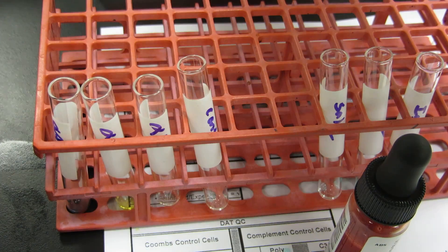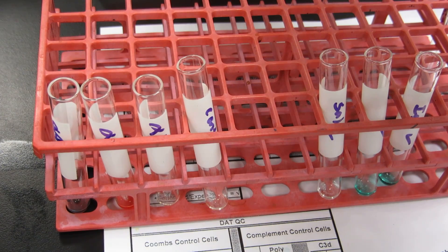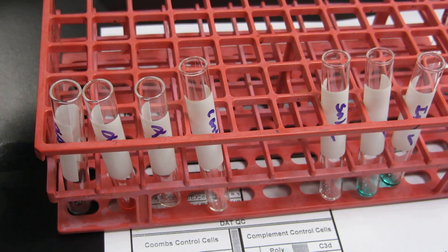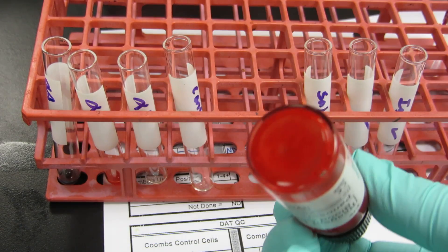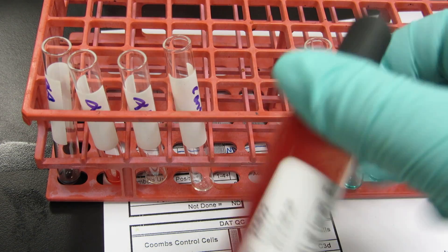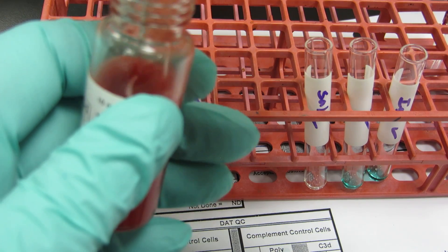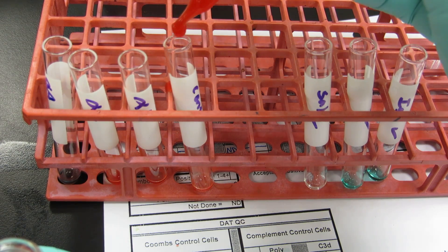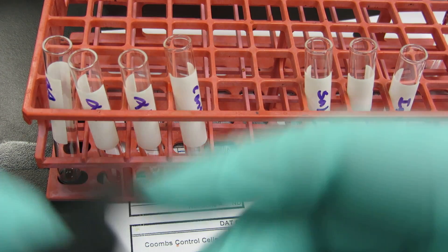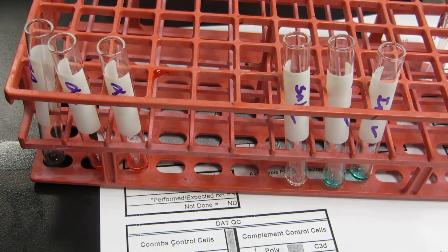Now for my D and my RH control, I'm going to grab screening cell 1 or screening cell 2 — in this first module it doesn't matter. Re-suspend, and I'm going to put one drop because we always use one drop of commercial cells into each of the D and RH control tubes. I missed there on the first drop, but I've hit the tube now — so that was one drop, I just missed on the first. My apologies.